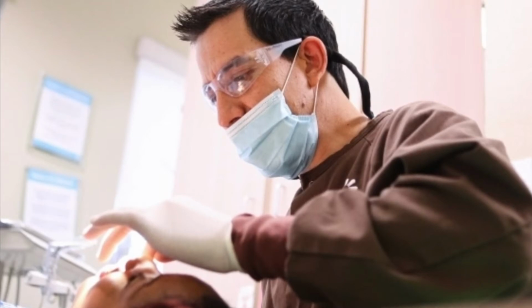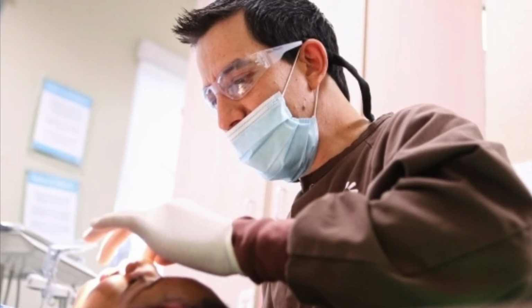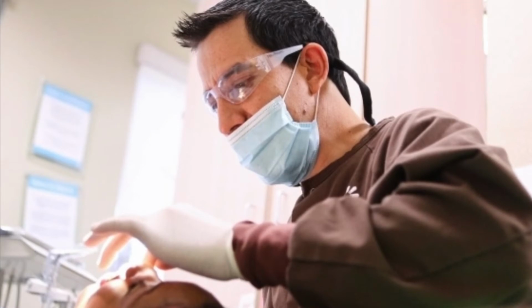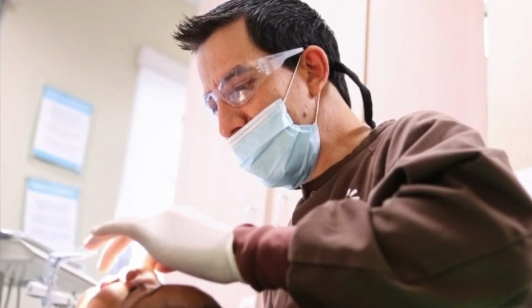Number 5, confirm the position and adaptation of the filling points. Number 6, evaluate and recall films the success or failure of endodontic treatment.